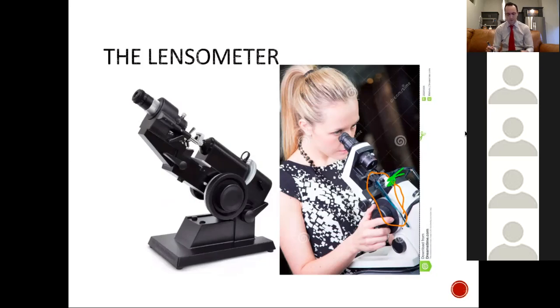Another important comment about the lensometer is that we're actually not measuring the true power of the spectacles, because we're treating the spectacles as a thin lens. So this is another way that they could ask us questions on the exam, and I want to show you what I mean by that. So let me see if I can press the right buttons here. Let's go ahead and draw a spectacle here.